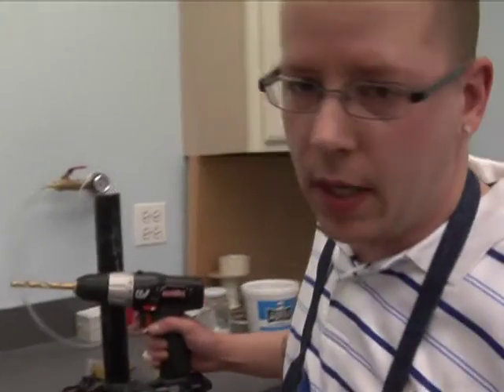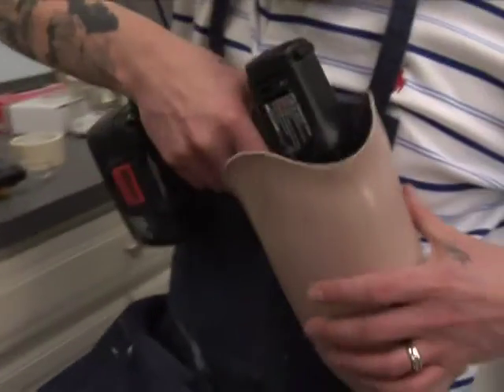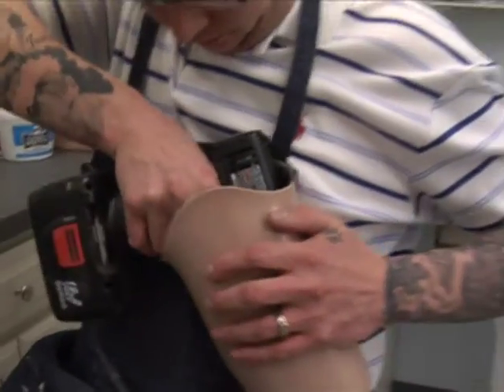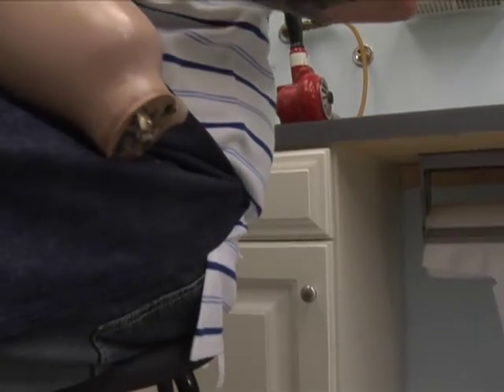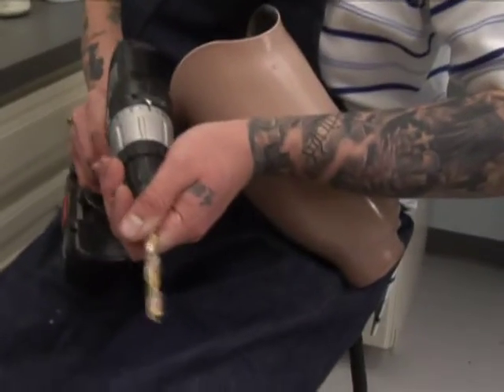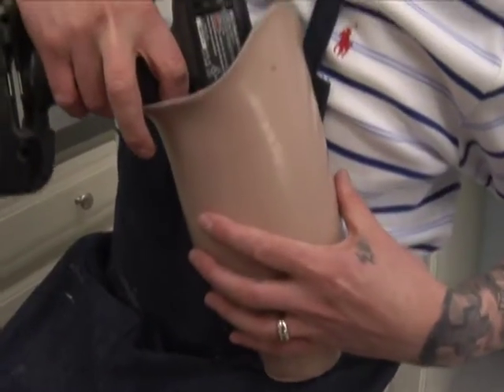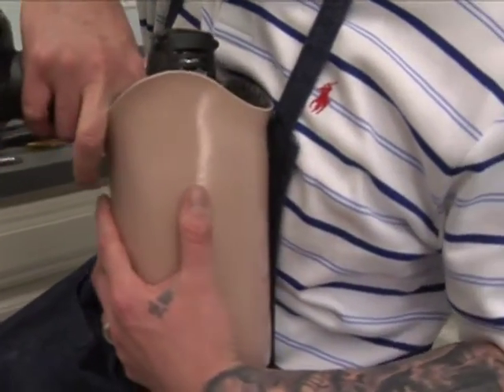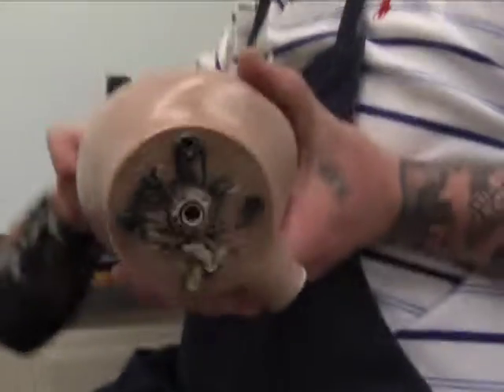We'll be using a 3/8 drill bit to drill out the four holes from the cap screws.